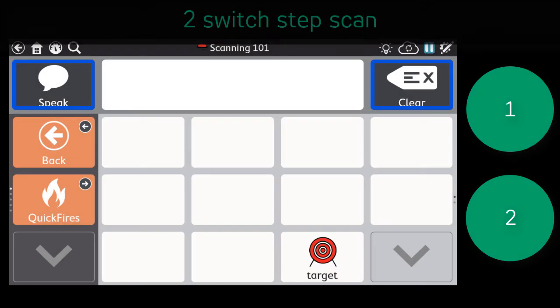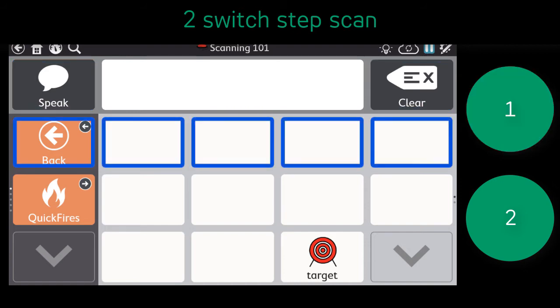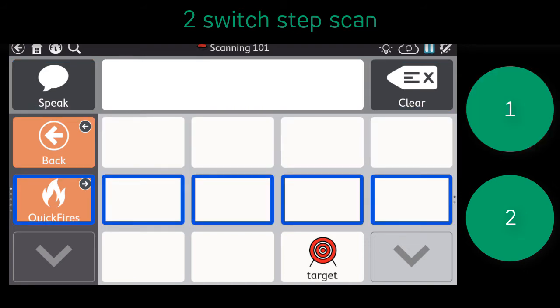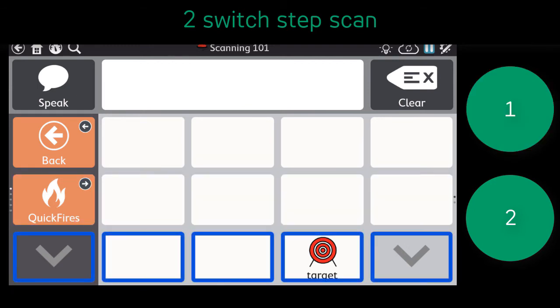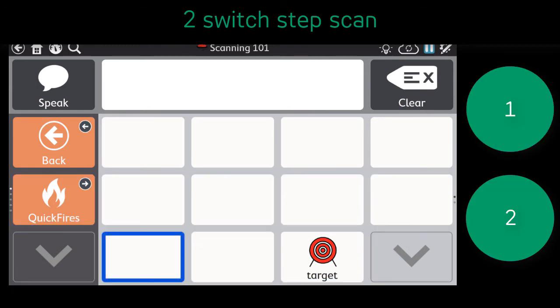In this video, notice the two switches pictured on the right. As you can see, the individual will use switch 1 to advance the scan pattern, then will use switch 2 to make a selection.